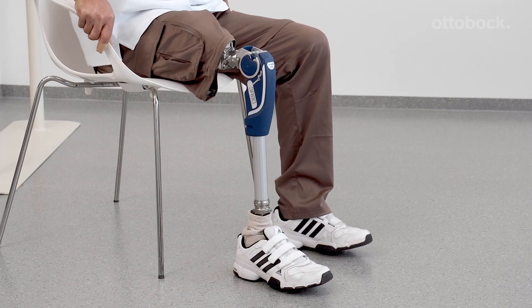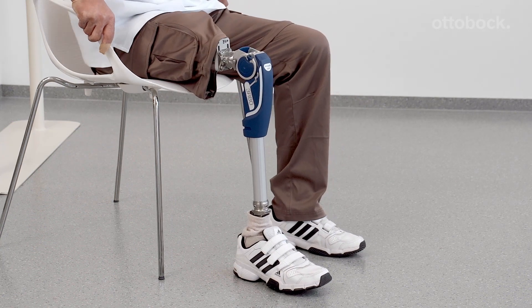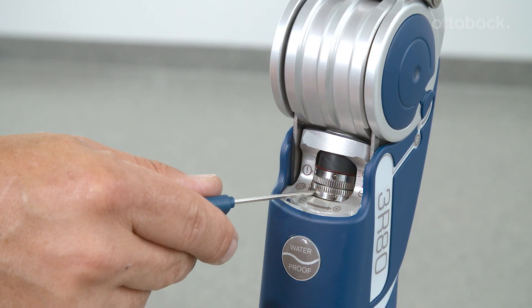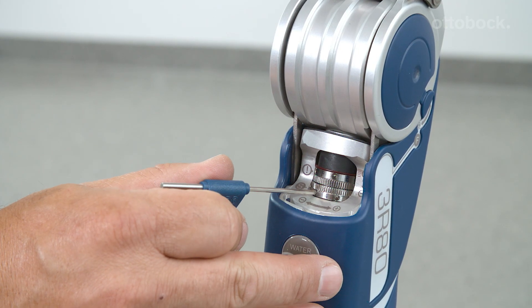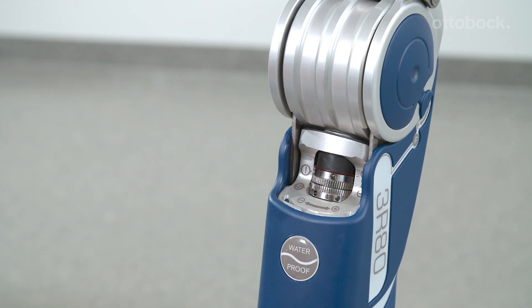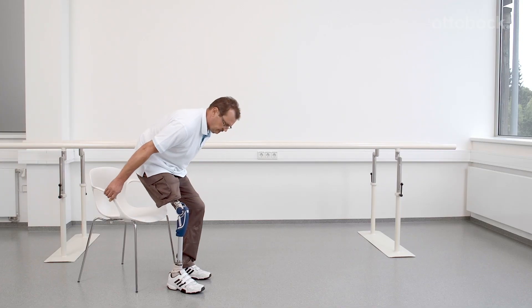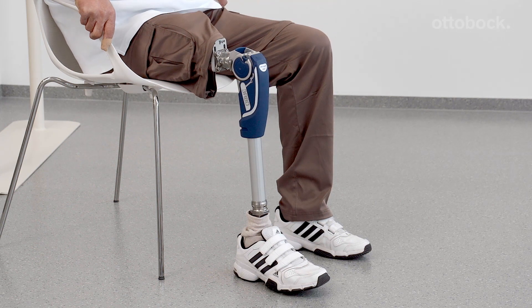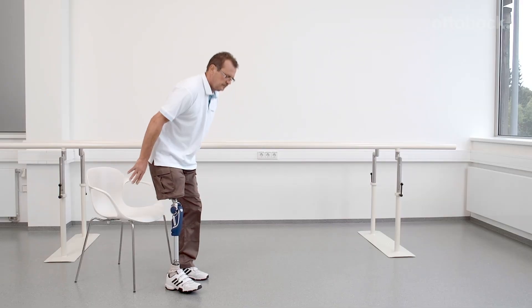With this setting of the stance phase damping, the user has no support when sitting down. The stance phase damping should be increased gradually. Sitting down needs to be practiced. The user needs to learn to sit down with the help of the stance phase damping to relieve the contralateral leg.